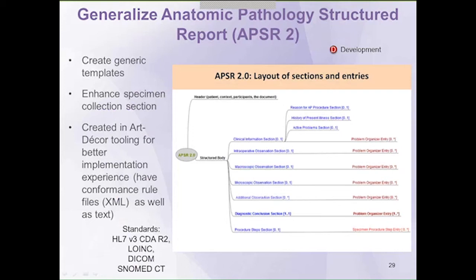So one of the challenges in the anatomic pathology world has been in the codification of discrete data elements to enhance machine understanding and automation. Most pathology reports of the past, I would say mostly distant past, but also today, consist of verbose text that requires significant natural language processing capabilities in order for a machine to try to deduce what is being written and conveyed in particular aspects of an anatomic pathology report.